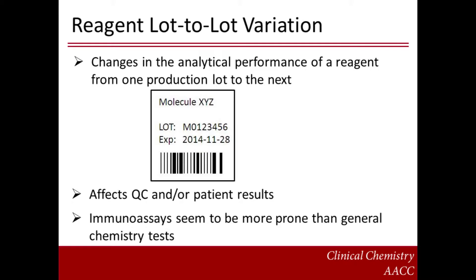In rare instances, for example, patient results with the new reagent lot may show a significant bias compared to the old lot without a similar effect being observed for the QC. Reports on lot-to-lot variability seem to be much more common for immunoassays than general chemistry tests, suggesting that the former are more prone to this problem.